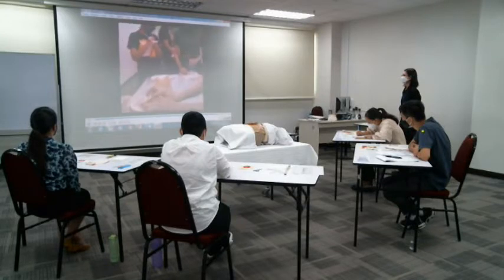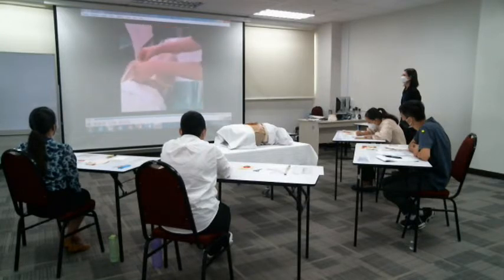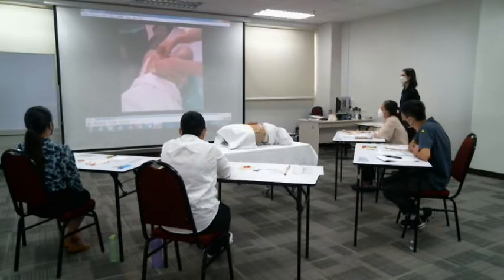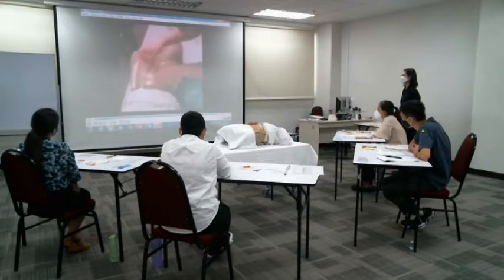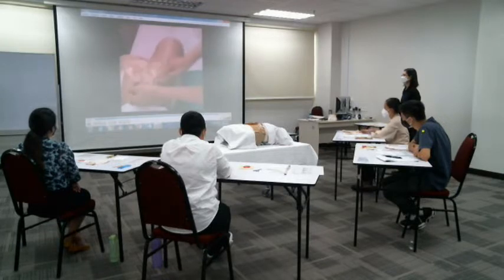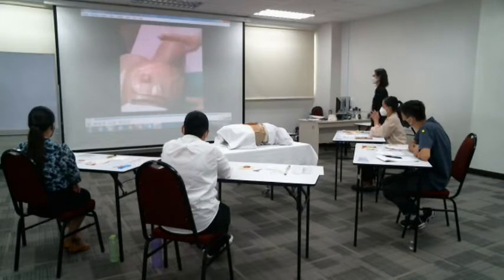Okay, then you must go around the ring, ensure that you hear a click sound. Right? Go around and after that, click and check. Make sure no leaking. Leaking of feces makes the patient very depressed. Okay? So make sure. So it's all fixed already. Okay, so it is done.